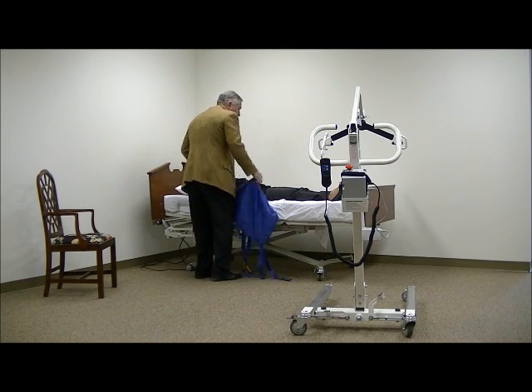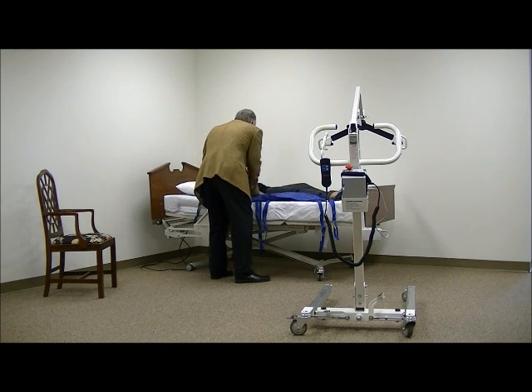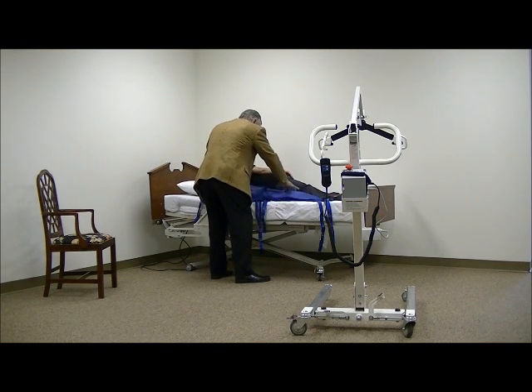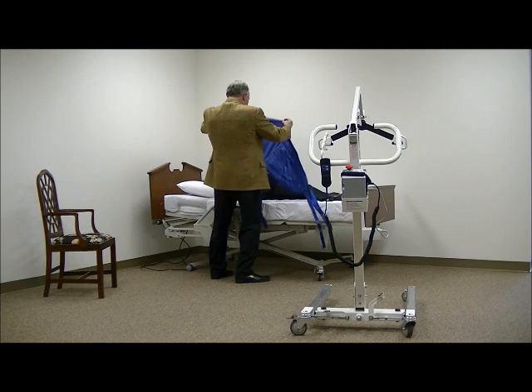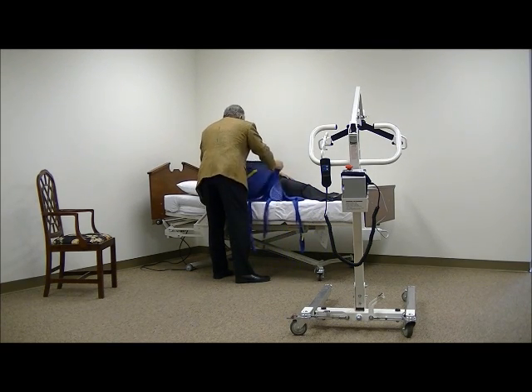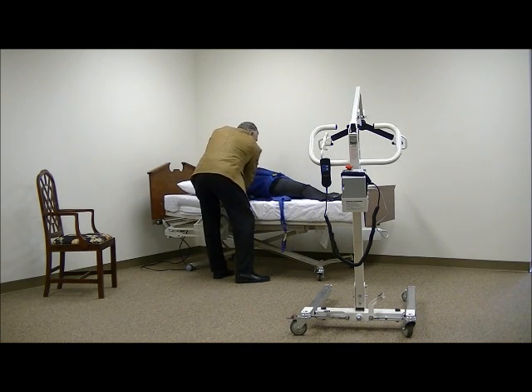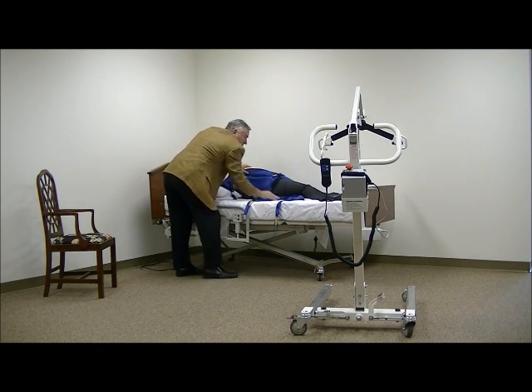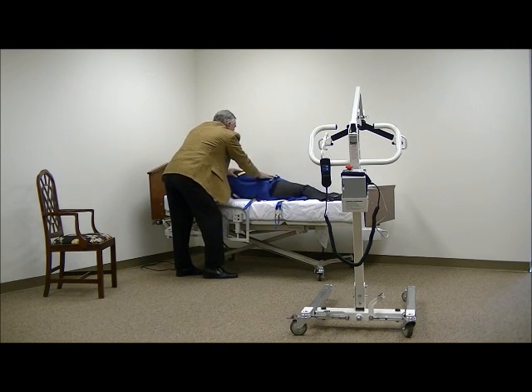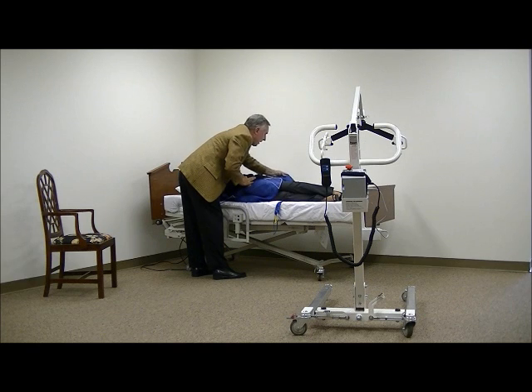And so then you're going to want to roll your patient over just slightly, like so. Take that sling that you folded in half and tuck it in the right position. Put it over the shoulder, flip this piece of material there, and then tuck some additional material underneath the patient. So you can see what we're doing here. Then we flip back, and then we come back the other way. And then pull the sling back underneath.